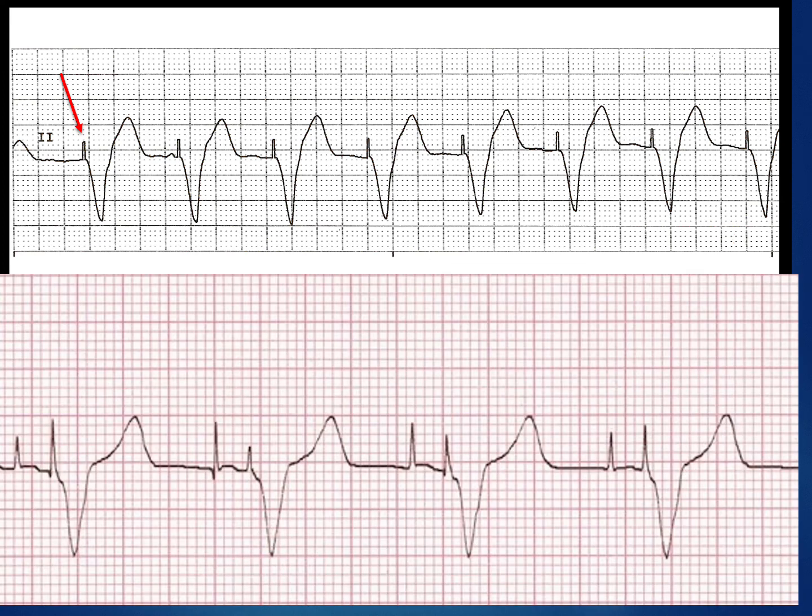Last, let's look at this strip. So what's going on with this patient? Pause the presentation again and consider your answer. Now I see two skinny spikes. So the first spike is followed by a flattened P wave, and then immediately after that I see another spike, which you can see in this case isn't a perfectly vertical line. It actually looks like a very skinny upside down V.